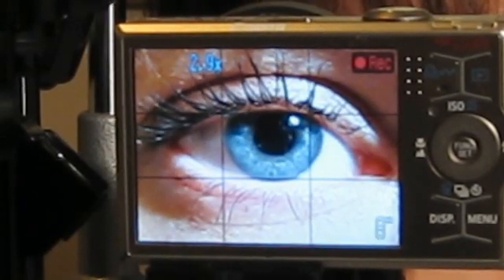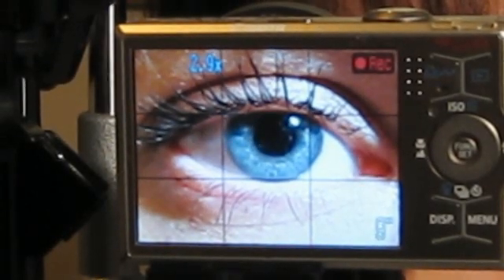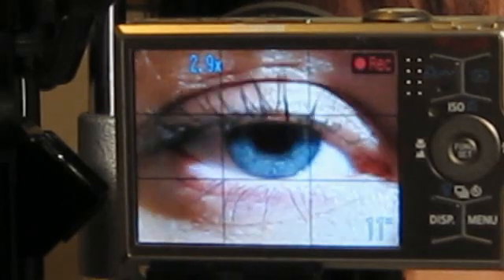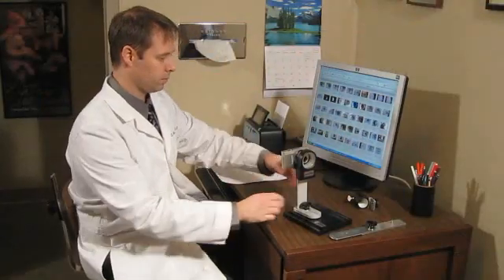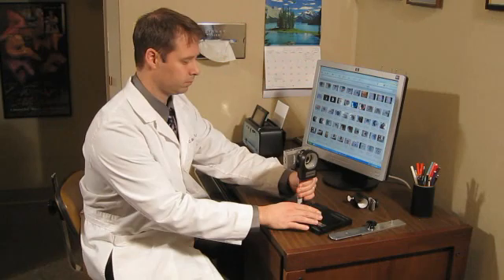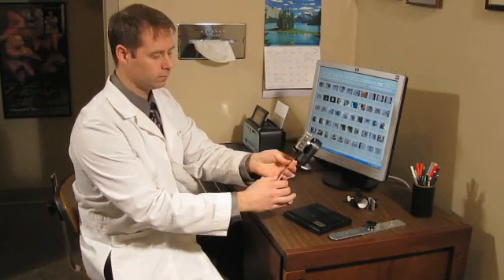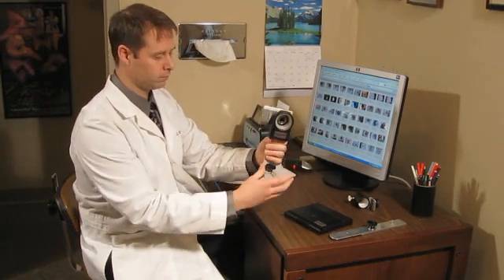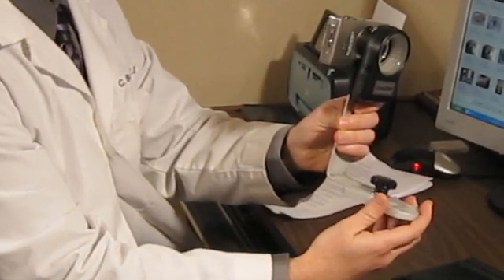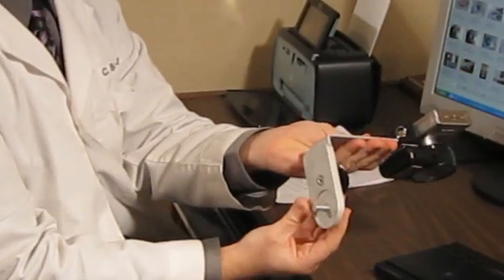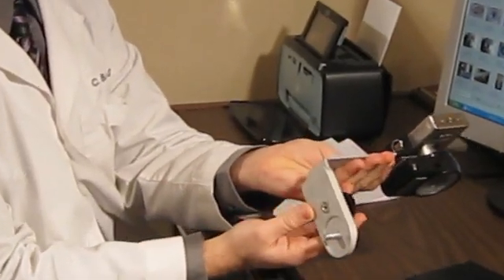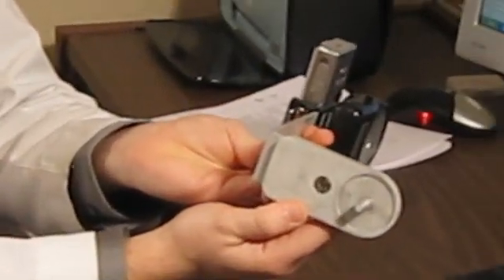All images shown, including this video, were recorded with the small Canon cameras. Dr. Bauer is demonstrating the bracket with an adjustable arm that allows the integration of the slit beam with the camera. The spindle beneath the bracket securely connects the system to the slit lamp carriage.